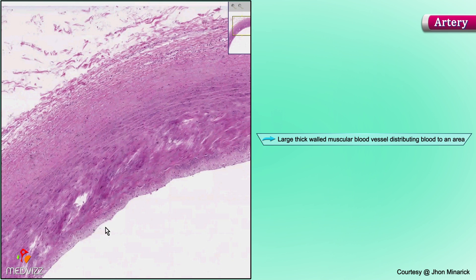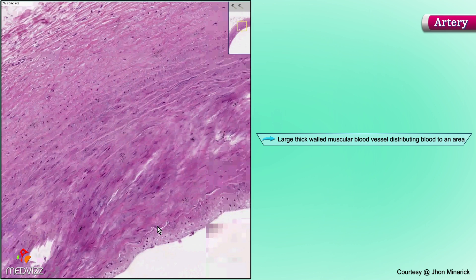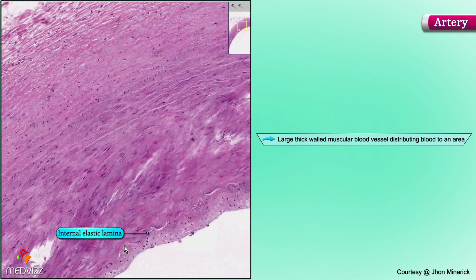An artery, no matter what size it is, will always have a fairly thick rigid wall. It will have a squiggly internal elastic lamina, like we saw in the slide of the aorta — kind of a squiggly internal elastic lamina, like we can see here. See this wavy little light thing? That's an internal elastic lamina.